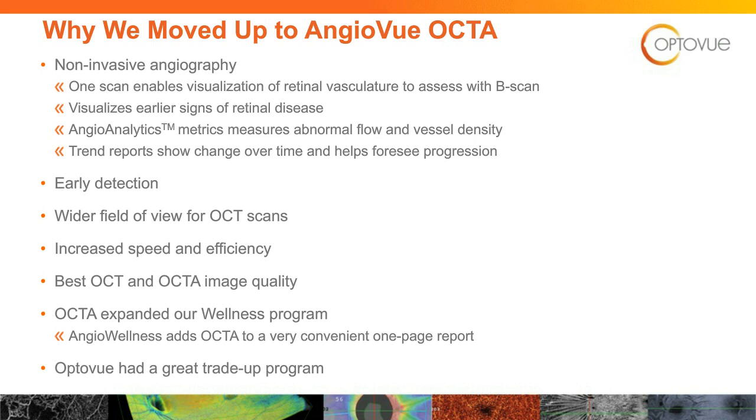Really, angiography brings macular degeneration right back into play, being able to find occult or see classic membranes, or to see drusen that are suspicious and see that there's really no activity going on. And more importantly, where you think things are not suspicious, being able to pick up that choroidal neovascular membrane, or that net that's either in the retina or in the choroid.